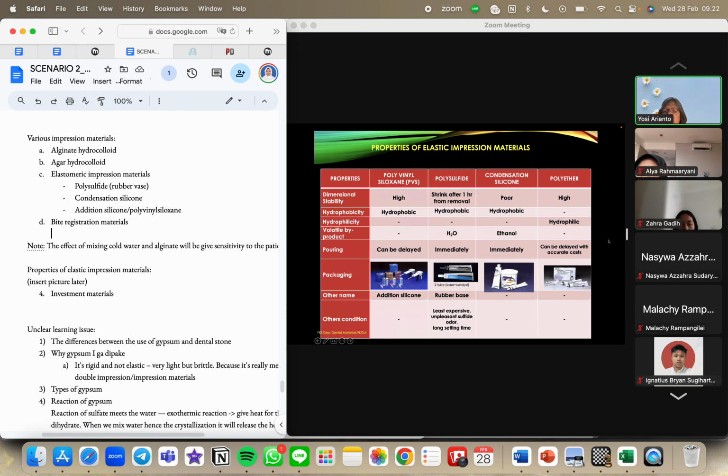But it is hydrophilic, so you are not supposed to have contamination from water. So you should be very careful in using this polyether because of the saliva in the mouth. Also, pouring the gypsum can be delayed while still giving an accurate cast.